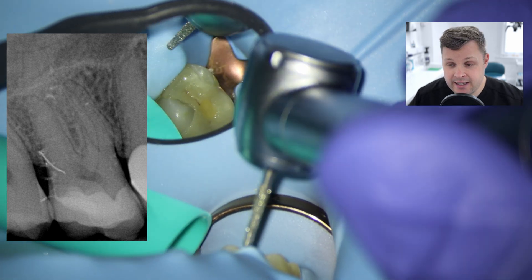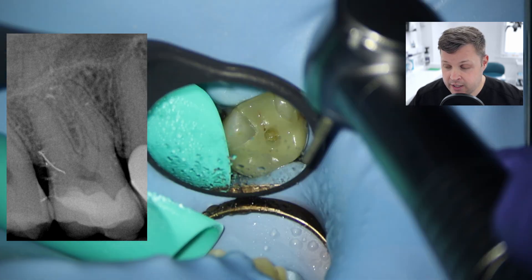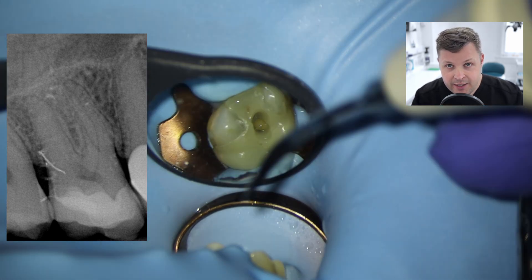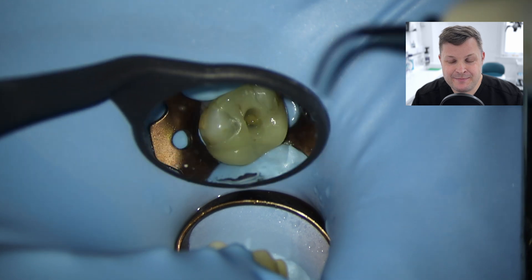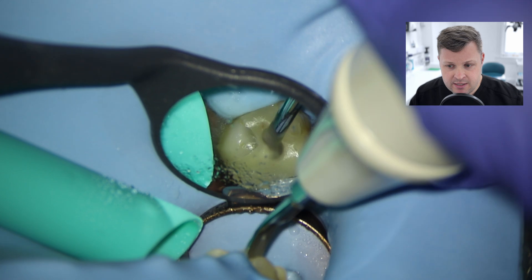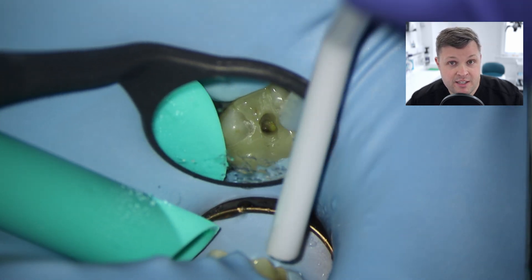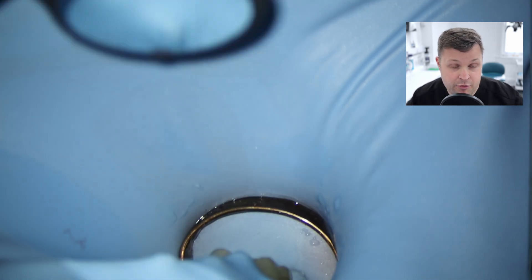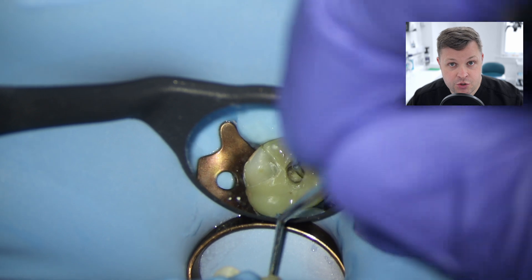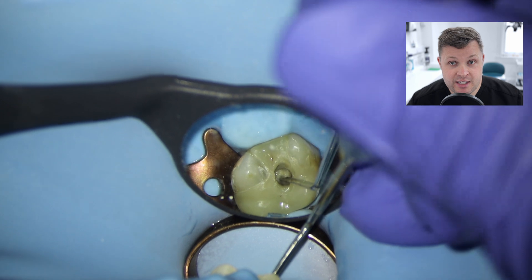Essentially, this tooth has got a ceramic onlay - I believe it's a ceramic onlay, it looks like one. It was a referral from another dentist who had accessed the tooth, but only accessed a tiny, tiny sort of pinprick access cavity. I thought to myself, what I could do is remove this expensive ceramic onlay, or I could just complete the root canal within the confines of this access cavity that the referring dentist had got to. So at this point I wasn't entirely sure if I was going to remove the whole restoration or continue with this small access cavity.